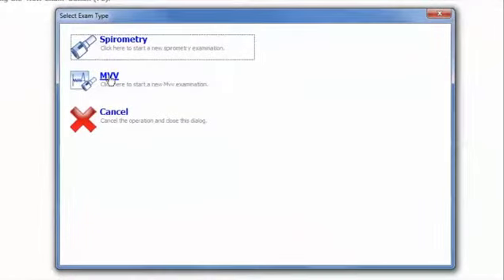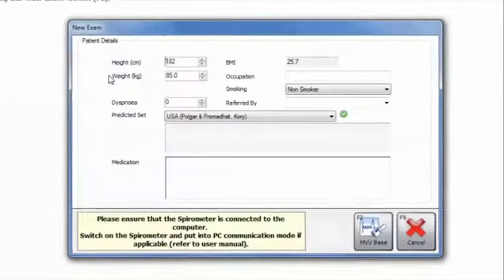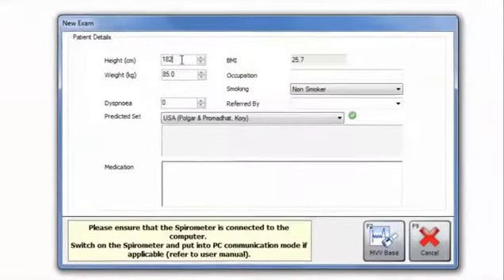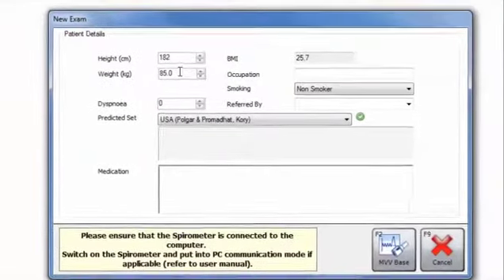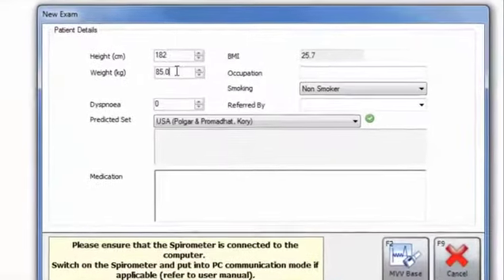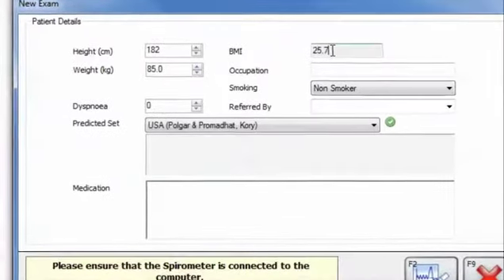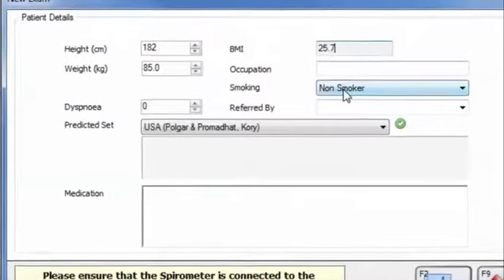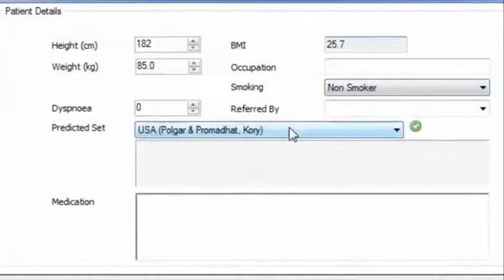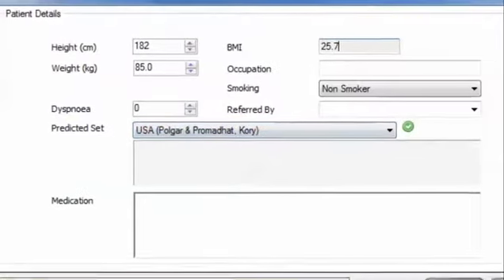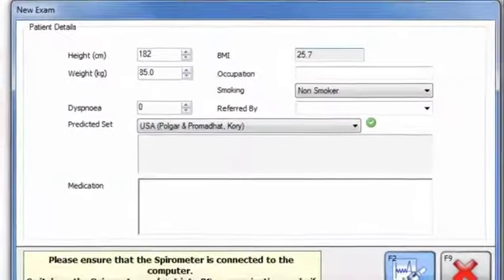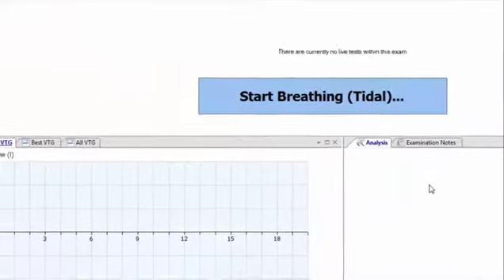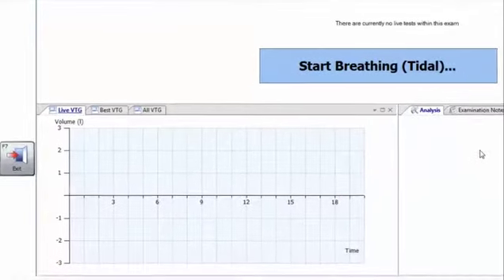Select the MVV icon and a dialog box will appear containing the patient's height and weight. Details can be amended and also added, such as the choice of predicted values for the MVV test and also the patient's current medication and who they were referred by.